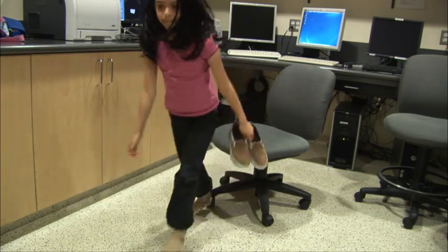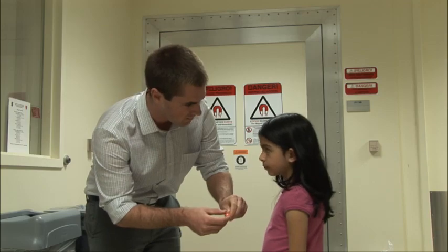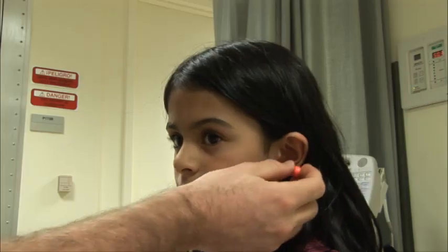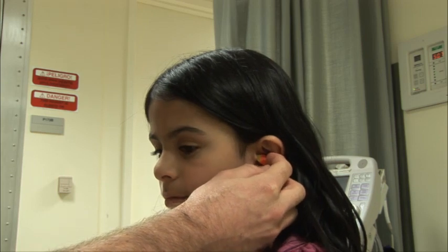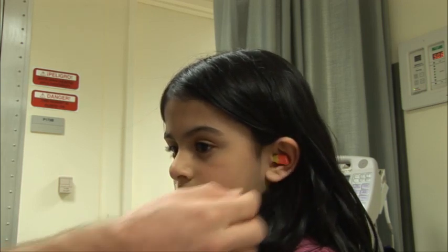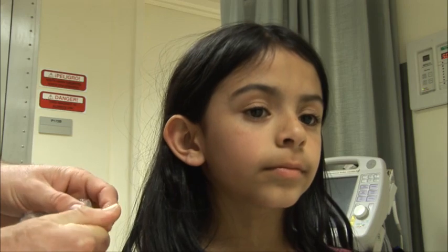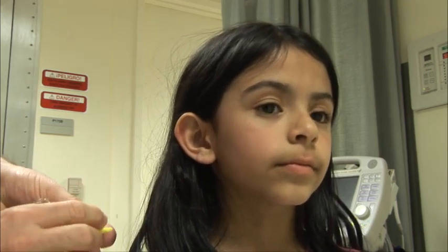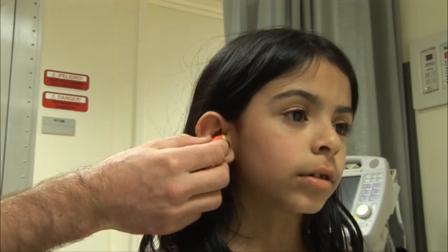The scanner is very loud, so you will have to wear earplugs or special headphones to protect your hearing. The scanner makes sounds like a fast drum and some beeps. Here's one of the sounds that the scanner makes. And another. During a scan called a DTI, the scanner will make some different sounds and the scanner bed may move a little more. This is normal, so just relax and keep enjoying your movie.